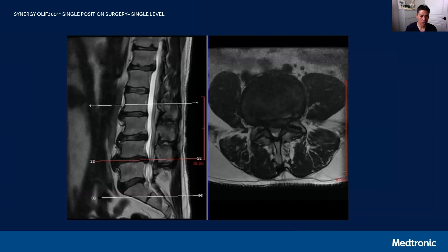Here's his preoperative imaging showing L4-5 disc degeneration with significant posterior disc protrusion, which contributes to central canal stenosis. The things to note on this preoperative MRI are the corridor — we can see the left iliac artery here and the belly of the psoas here. There's a nice corridor in which to dock, but one of the things that can inhibit you is that this gentleman has a very large psoas muscle.